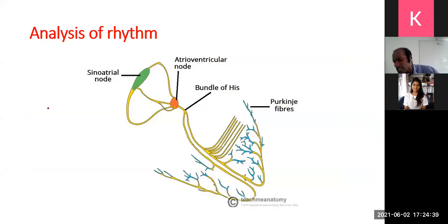Now what did I say? What is rhythm? Rhythm is where the predominant activity starts. Where does the predominant electrical activity start? Now, there are several places where it can start. If the predominant electrical activity starts, is the onset, that's what's driving the electrical activity now. If it starts in the SA node, which is the normal place, it is called a sinus rhythm.